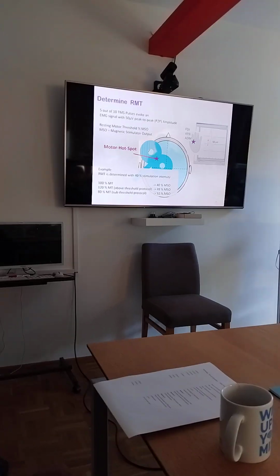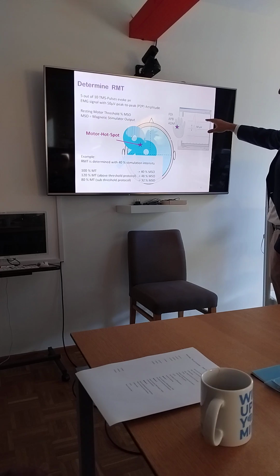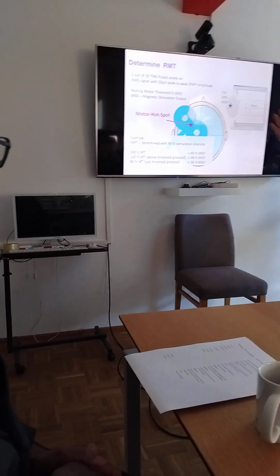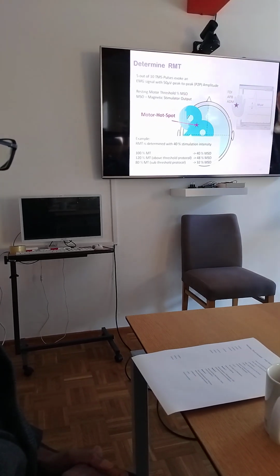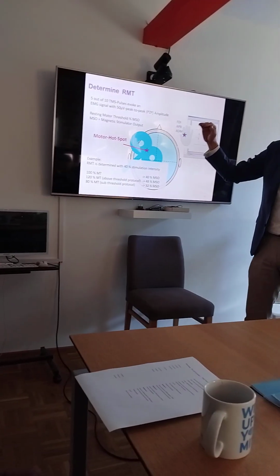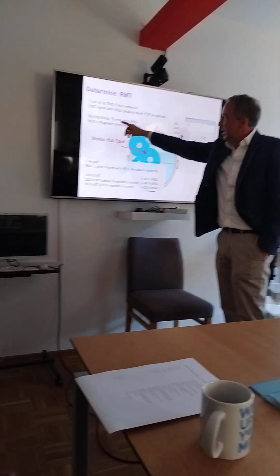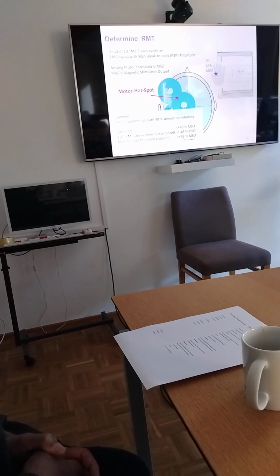Okay, here again it's 5 out of 10. The EMG we can forget about, because you don't have this option. And here, as I said, the magnetic stimulator output, the MSO, means 100%. The resting motor threshold, the MSO, defines the individual level where you can see a reaction. And with this level, you will also do the treatment, the stimulation, later. So it's very important to have this as precise as possible, because this will have a massive impact on the success of the treatment.